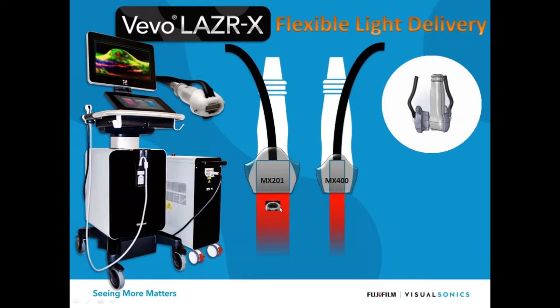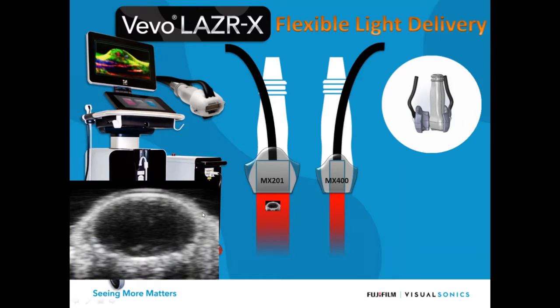So yes, we've designed fibers which accommodate the full imaging width of each of these transducers, but let's say, for example, you're imaging something like the mouse brain. You can't see it very clearly in here. It's a very, very tiny image. This is actually an approximately properly scaled image of the mouse brain here, and I've blown it up over here at the side so you can see what that looks like. But as you can see, it's very small, and you might say, well, why don't you just use a higher frequency probe? Well, we want to get through the skull to be able to see at least some structure and have some sensitivity through the mouse skull.